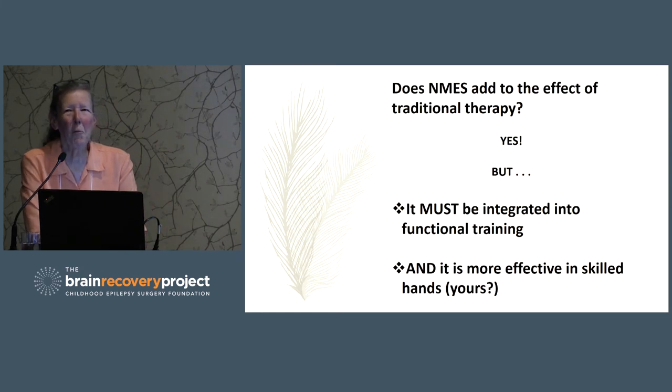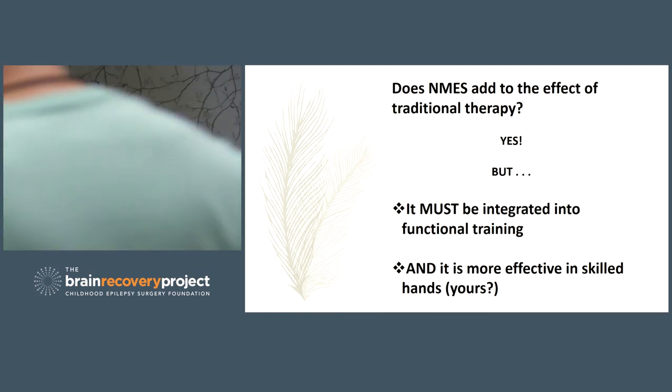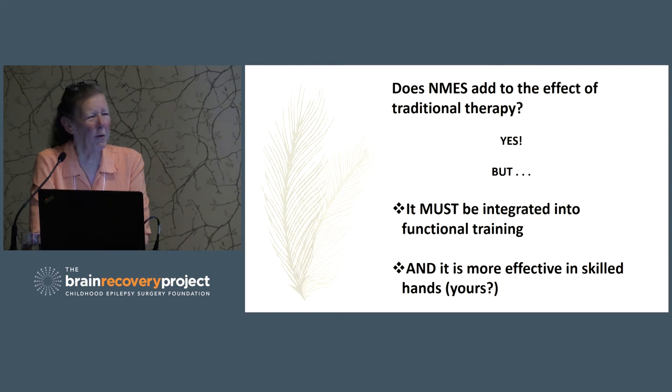And I've had two patients at Rancho recently. One was a high spinal cord patient, a C1 spinal cord patient, that wanted some neck stability, and we were working on that with him. And then I had a muscular dystrophy patient that needed gluteal stimulation, which fortunately, she was small, and we were able to get to the gluteus maximus and medius. So I'm a fan of doing what's going to be most important first. And if you get success there, move on to the second program.